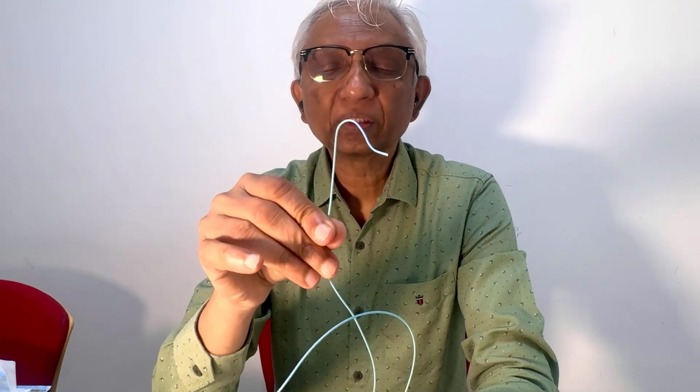But you may ask, is that the only use? No, there are several more uses. Because of this curve, you can enter intercostal arteries easily. So it's a very good catheter for bronchial arteries, for intercostal arteries. Then coming down, you can enter the celiac axis. You can elect the Simmons, you can enter the superior mesenteric artery, the inferior mesenteric artery, the renal artery, and you come down, you can enter the aortic bifurcation. Got it? So sometimes we use this just to recanalize an occluded vessel.